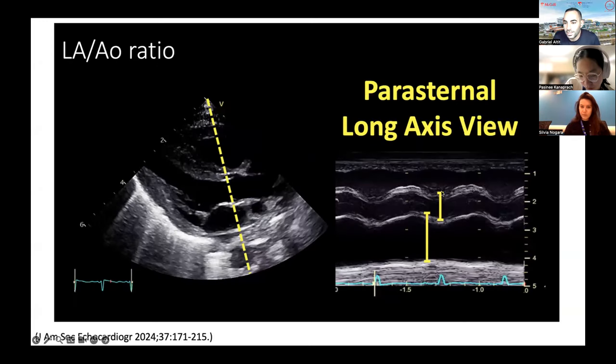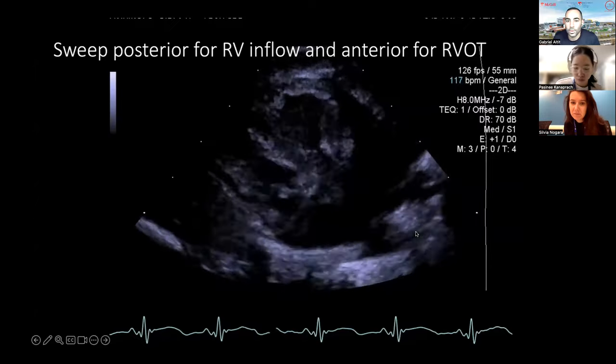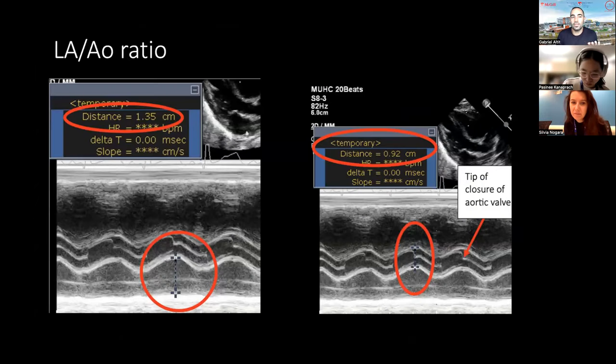And you can see here that's how they've done it. The initial literature measured from edge to edge, so you shouldn't really include the walls. Does that make sense to you guys? Yes. Okay.